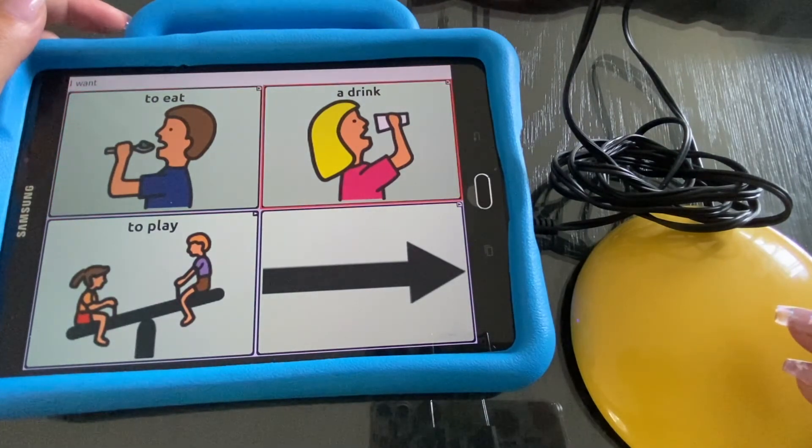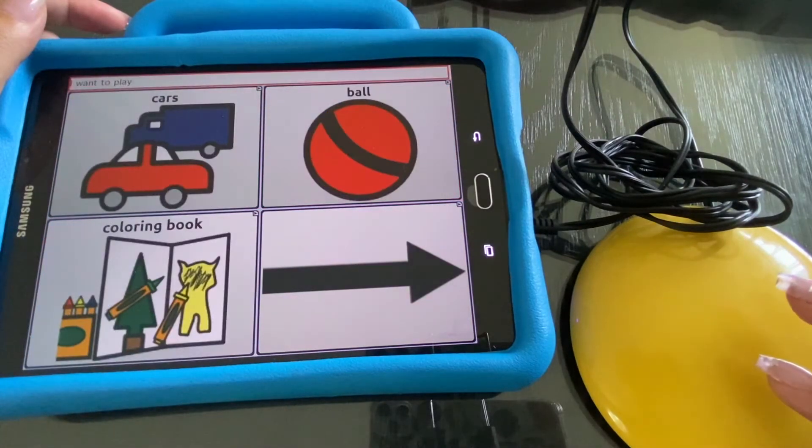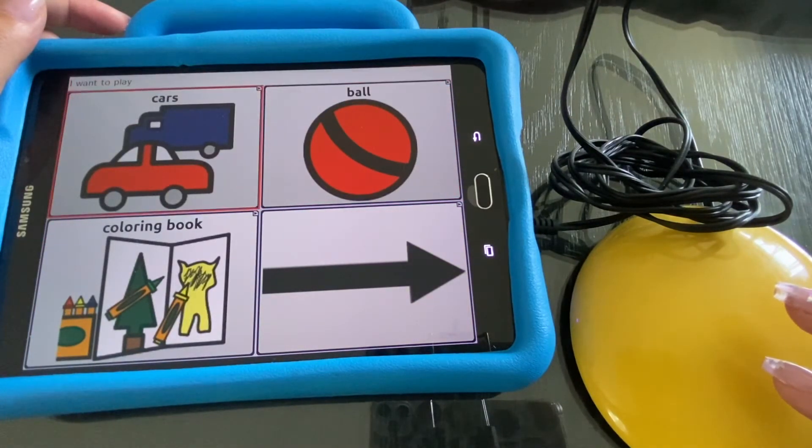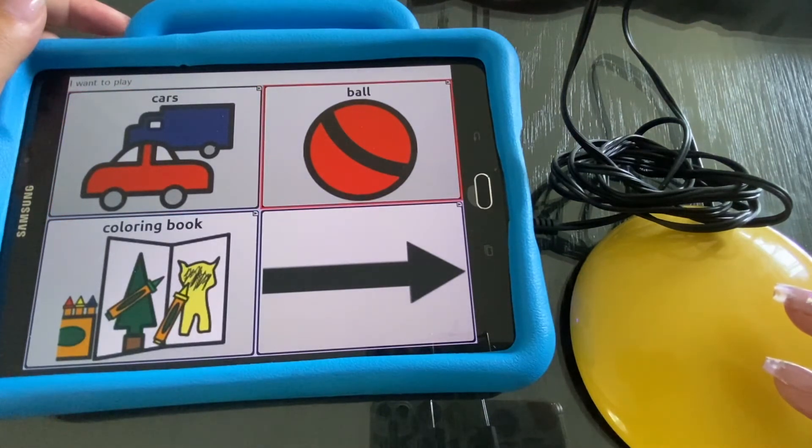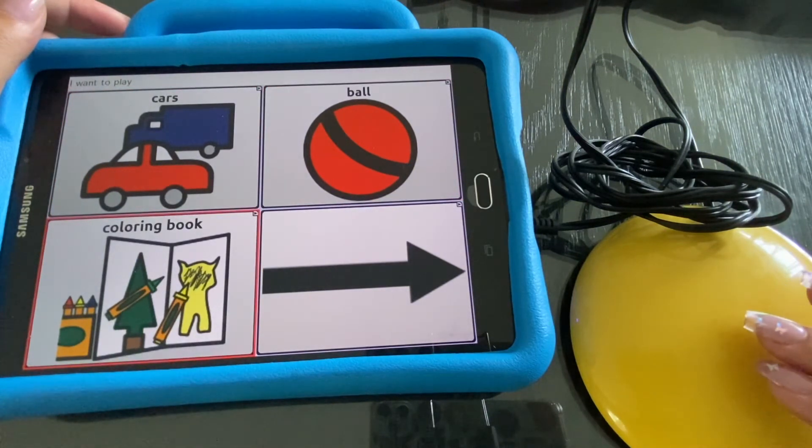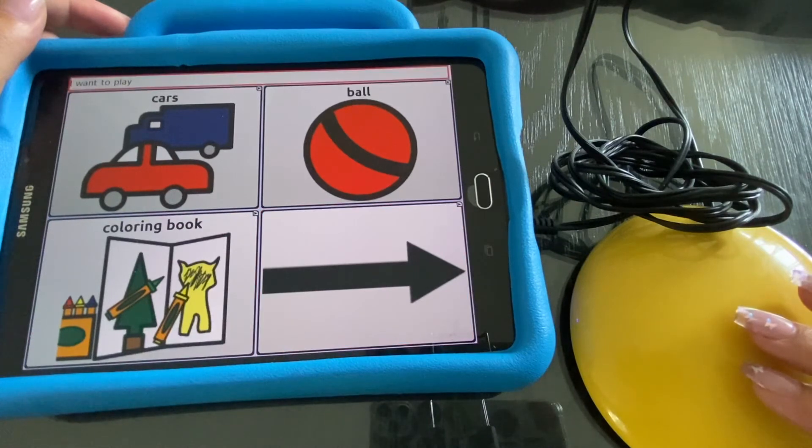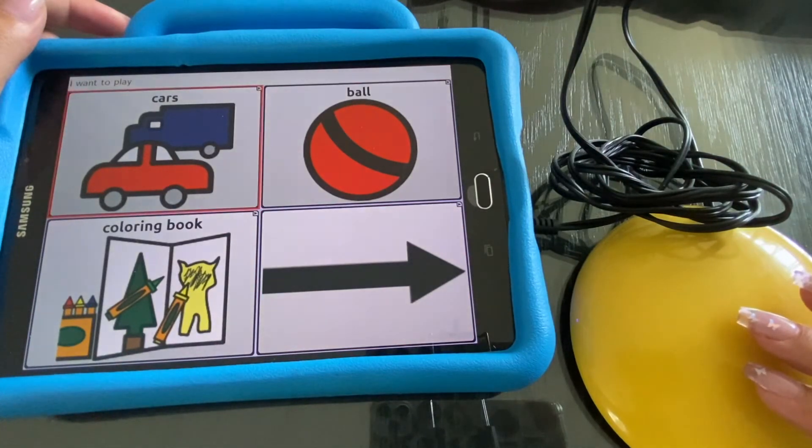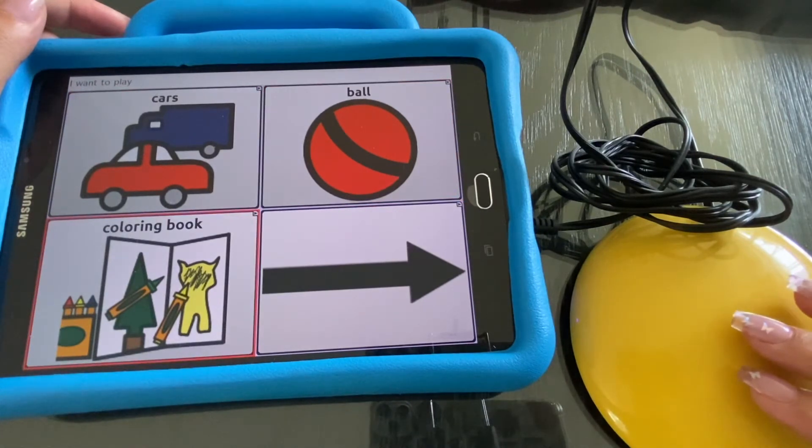To eat, a drink, to play. Speak text. Cars, ball, coloring book. Speak text. Cars, ball, coloring book.